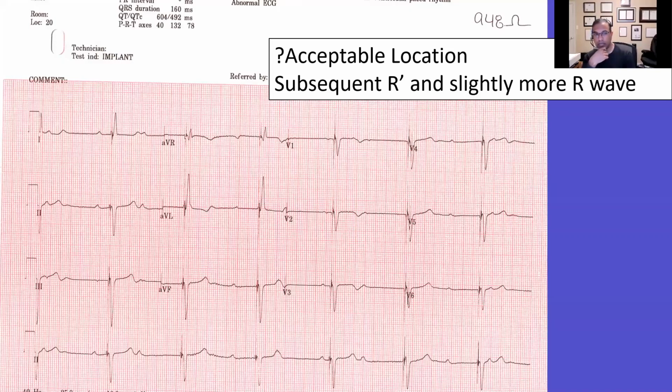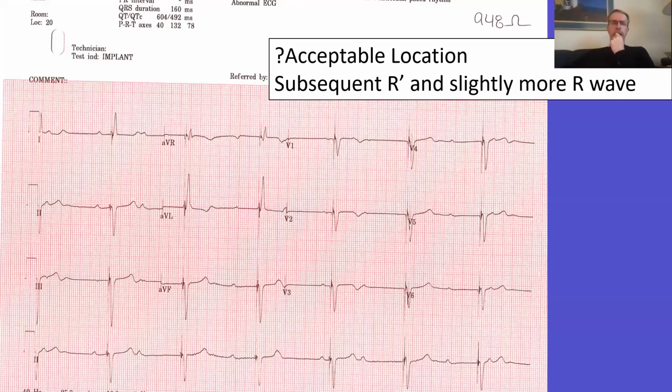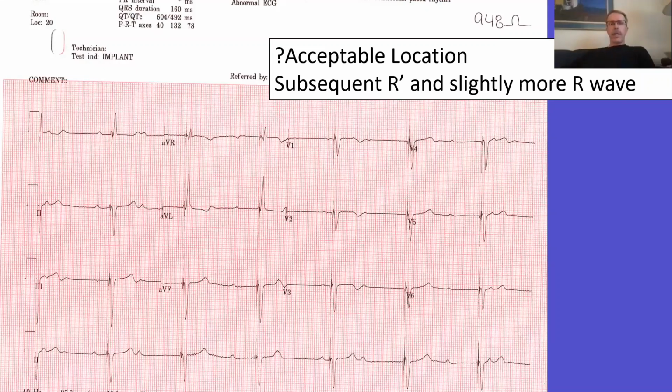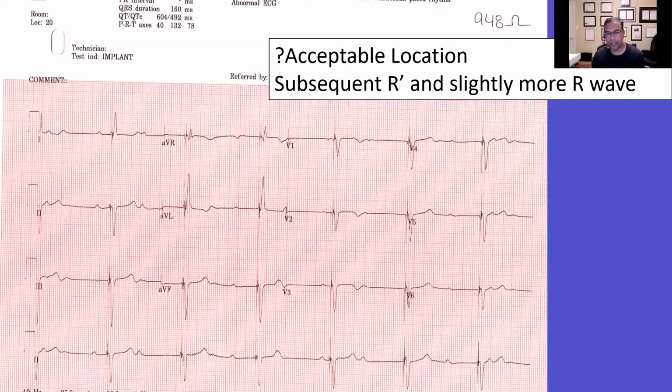Your QRS, sure, but it's very inferior, I think. Yeah, and your QRS duration looks beautiful. Everything here looks good, and I'm sure your LVAT time was good too. I'm just eyeballing it here, but everything looks really, really good, with the exception of that V1 morphology. So, do you often get this where you have no R wave across the entire precordium? This is the only case I've seen like this. No, that's a little unusual.